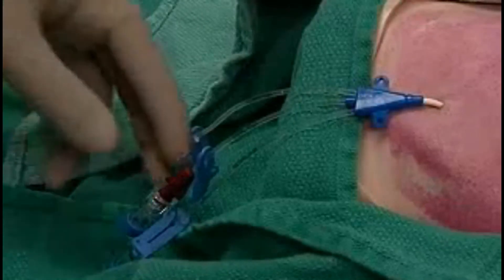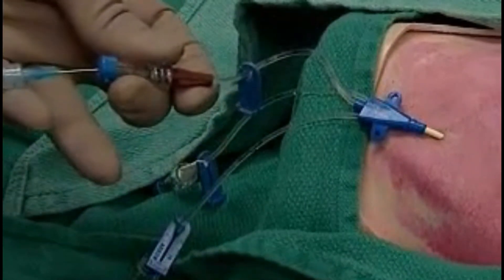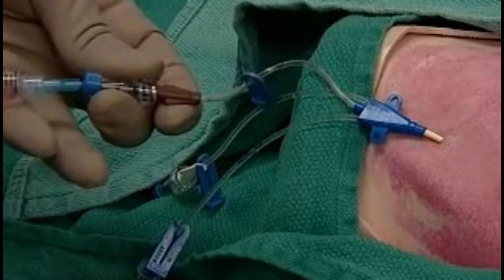Now an important check: put a syringe containing saline in the hub and make sure you can both withdraw and infuse fluids. You'll check all hubs in this way before suturing and applying a sterile dressing.